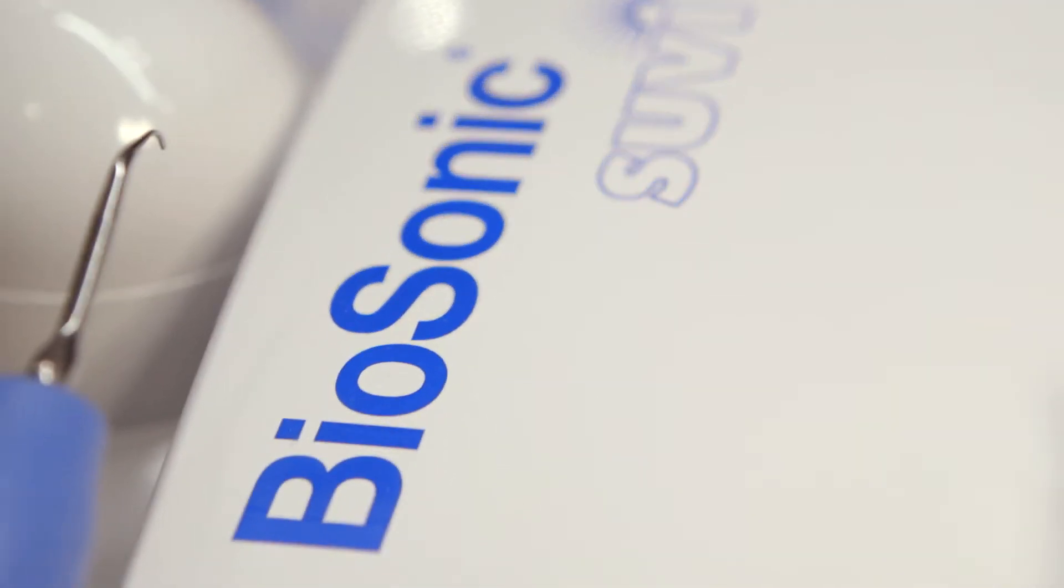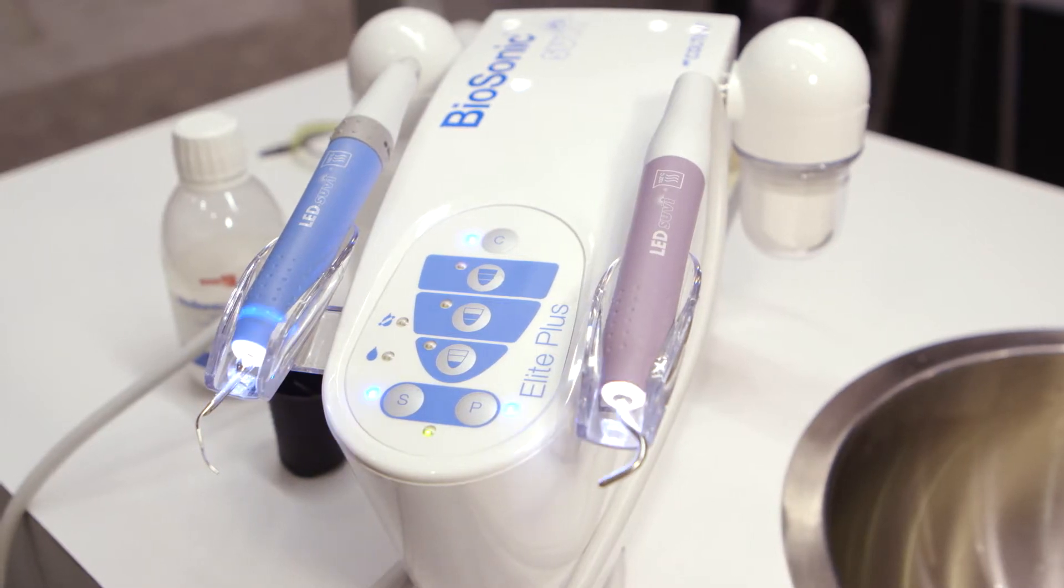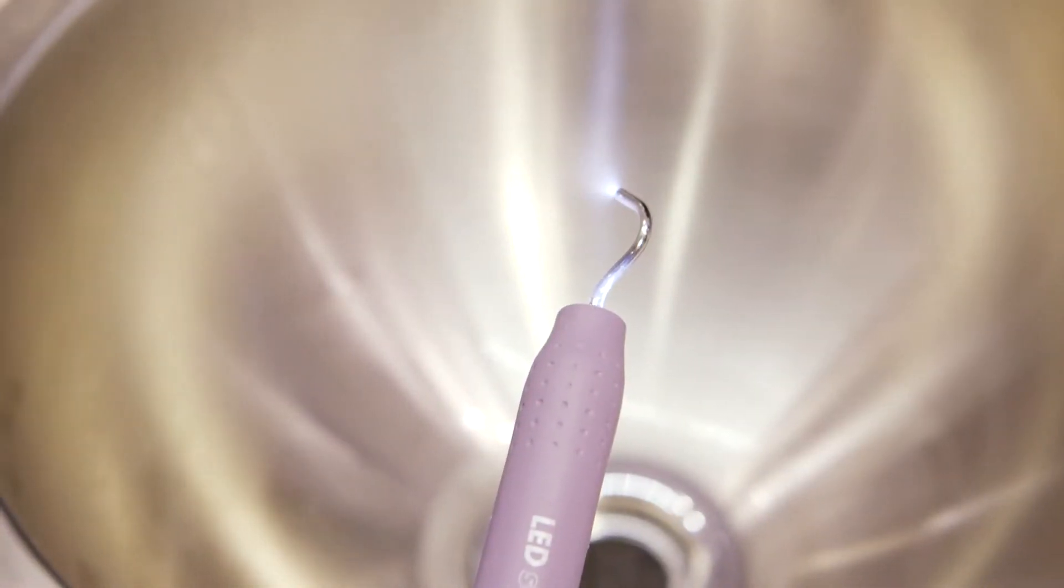The Biosonic Suvi Elite Plus is a combination unit of a piezo scaler and an air polisher. It's a single unit with two different handpieces: one that acts as the power scaler and one that acts as a power polisher.